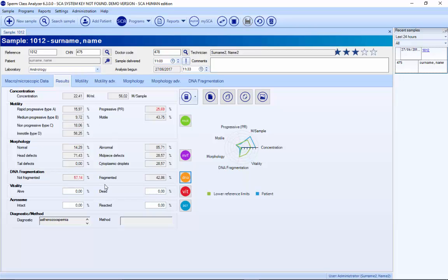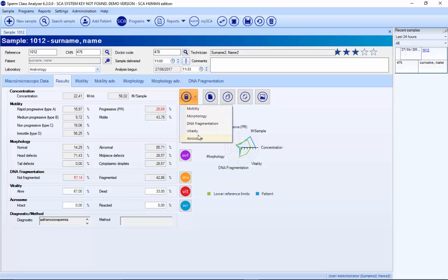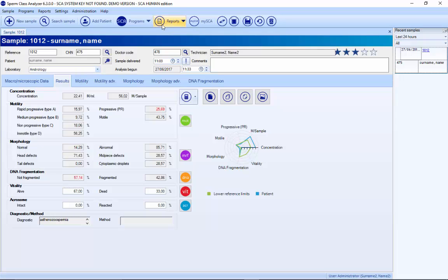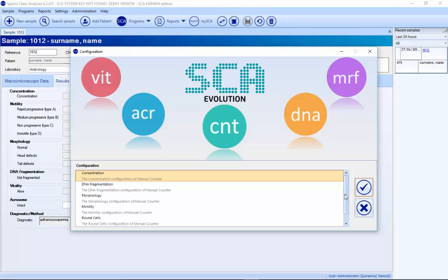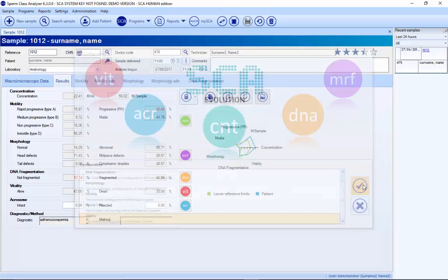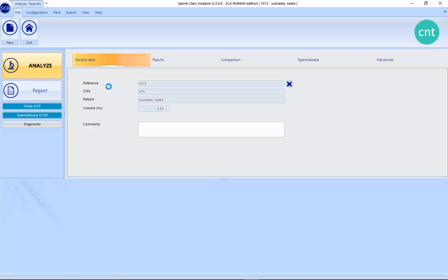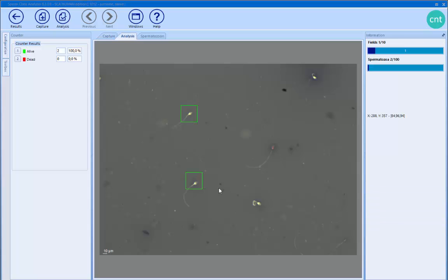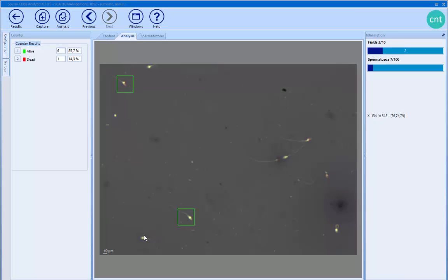In all the modules, if you don't have the automatic module, you can write the number manually and the system will calculate it automatically. It's also possible to do it manually with a counter. There are different counters — if we select vitality, we can do it with an image: pressing 1 for alive and 2 for dead, counting sperms one by one for all the images.